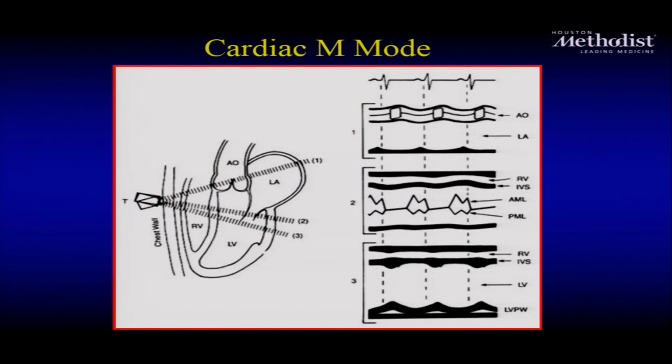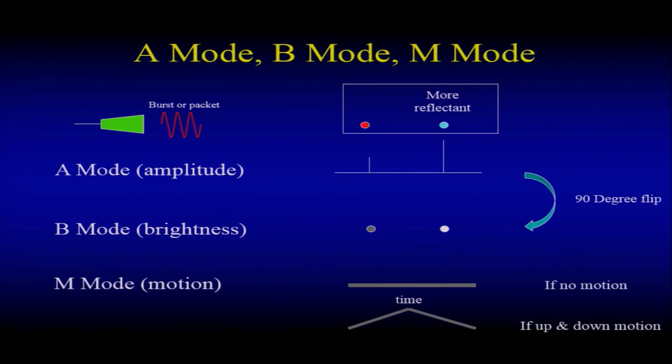Now, a few things about ultrasound per se. If I go back to these packets of ultrasound, usually for you to be able to see something and decide how deep this structure is, you're not going to emit continuously from this transducer, which has piezoelectric crystals. It's interesting, piezo is from Greek. It tells you that it is the pressure. These tiny crystals, if you press on them, either mechanically or electrically, they can emit ultrasound. And actually, they can be excited by ultrasound itself.